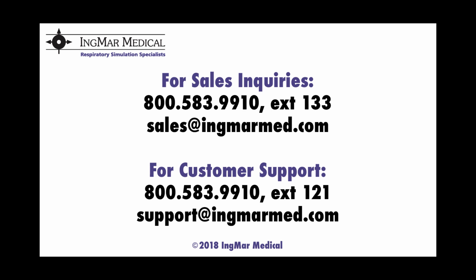Okay, thank you. Our next question here is from our friend Vivian. Hi, Vivian. Vivian asks, what are the sequence of steps to go through if the ASL software can't find the ASL? I would ask which connection type are you using there. If you're using Ethernet, the one thing you want to ensure is that you are on the same network. You want to make sure that you're having an IP address issued to your computer terminal and to your ASL 5000, and those IP addresses are on the same gateway, on the same switch. That would be the first thing.